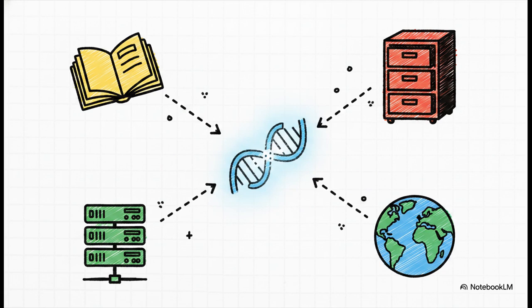And to interpret these genes, we definitely don't just guess. We cross-reference every single thing we found in the patient sample against massive, globally curated clinical databases. We use ClinVar to check for germline pathogenicity. We use COSMIC, the catalog of somatic mutations in cancer, to see if the tumor mutation has been reported before. We check gnomAD to ensure the variant isn't just some common, completely harmless population trait. And we use OncoKB and CIViC to gather the absolute latest therapeutic evidence.